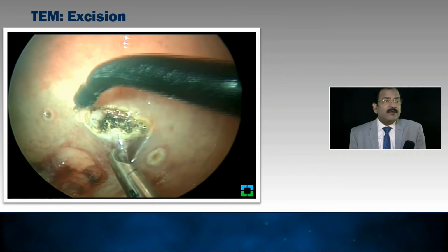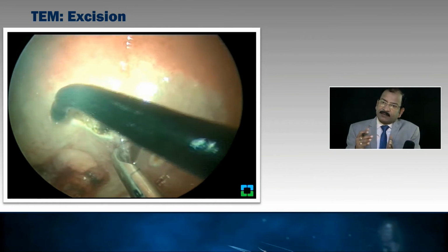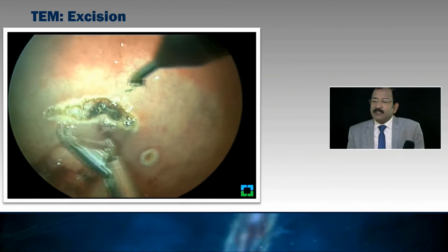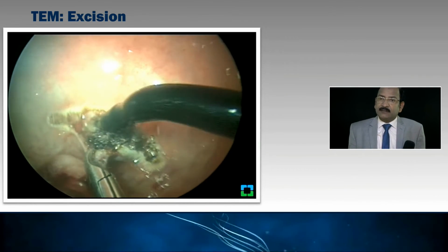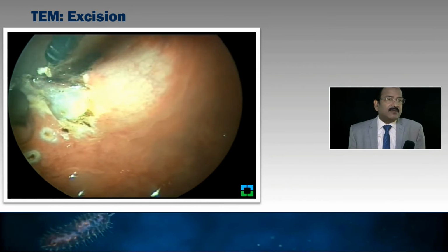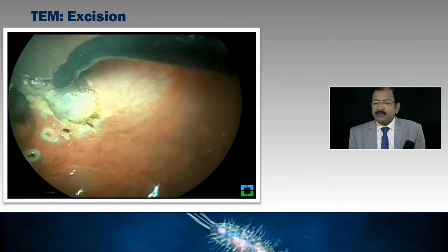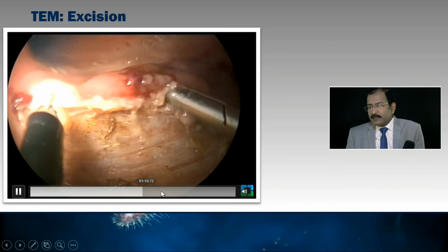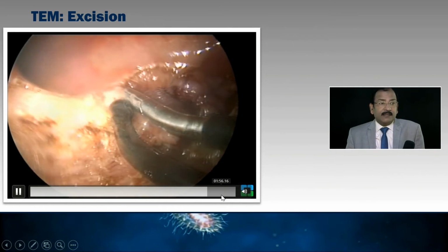These are articulating instruments. It will increase your manipulation angle, because just due to articulation you will get at least a 30-degree manipulation angle. Otherwise, they would be parallel to each other. That's why they are flexible instruments, also used in single incision laparoscopic surgery. Slowly, I will take it a little forward, and it is cutting, and now the entire tumor is resected endoscopically.